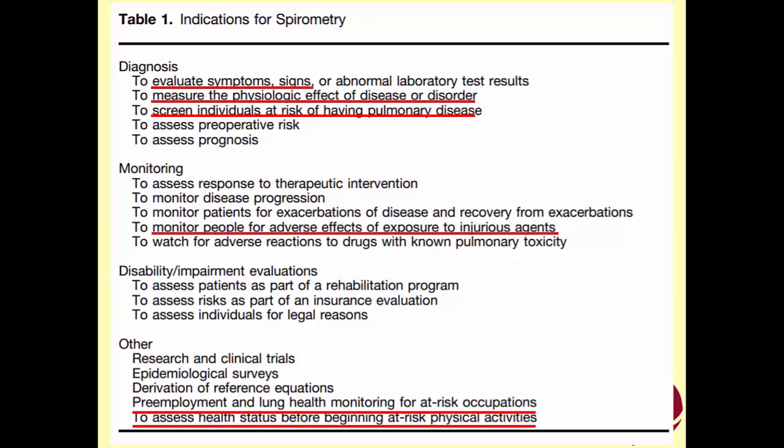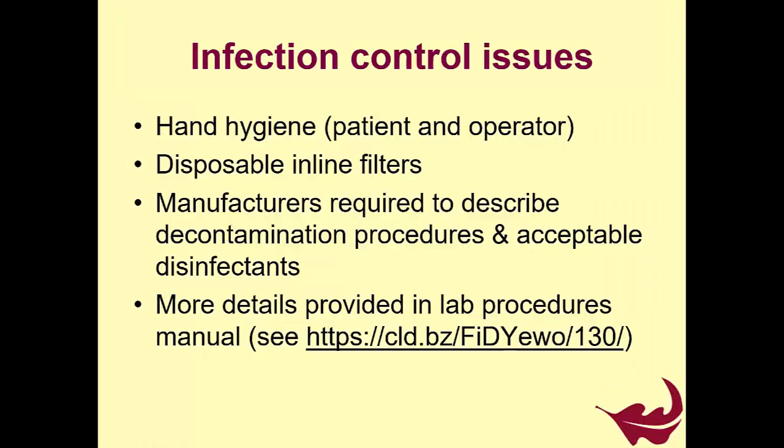So there is a difference between diagnosis of a person with symptoms and screening, which we do in a person that is totally asymptomatic and so forth. So just some of the things to keep in mind.